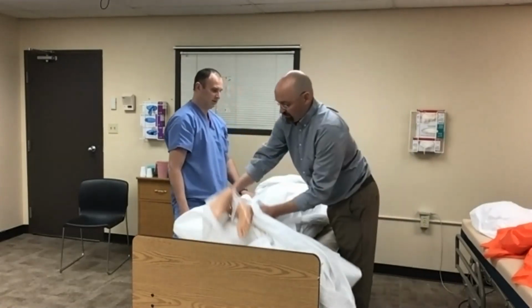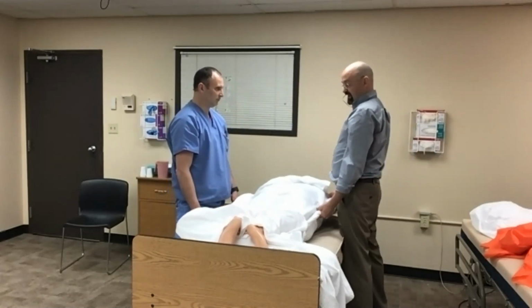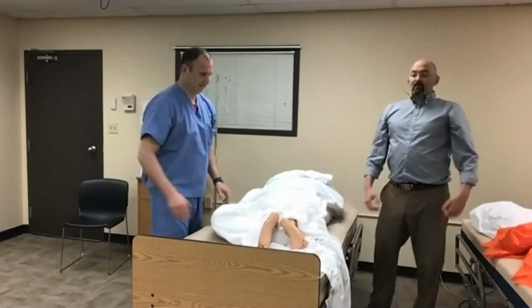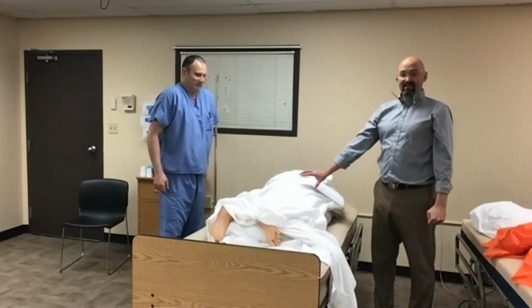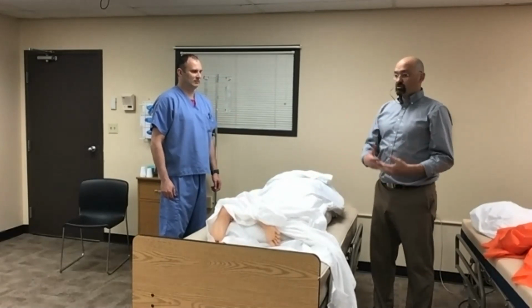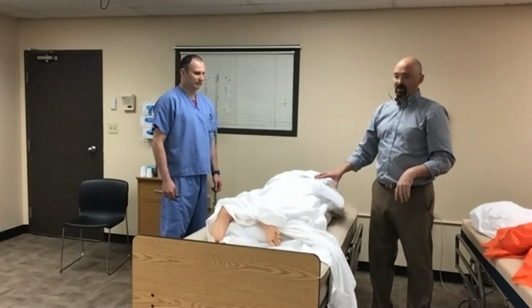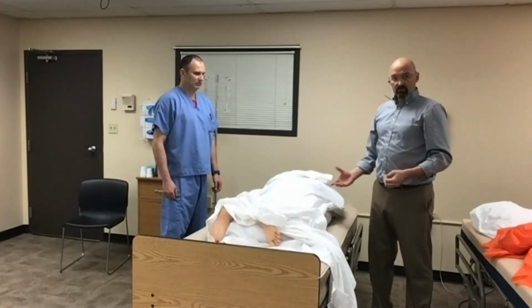Now, what you'll see in other videos is oftentimes they then need to grab that patient and everybody get around them. Go ahead and grab that side for me. And they go 1, 2, 3, lift, and they center and slide the patient up. Again, in our world, that is the absolute worst thing we can do both for our caregiver and our patient. Good, better, best approach. This is better than trying to manually turn them without anything and just trying to manually turn them in place. This is a lot safer for your patient and your caregiver. At least it gives you something. It is the last resort.